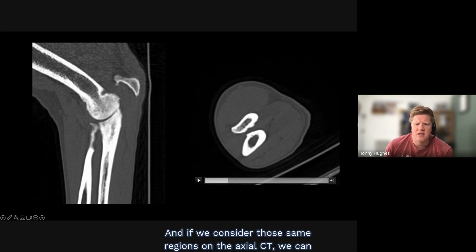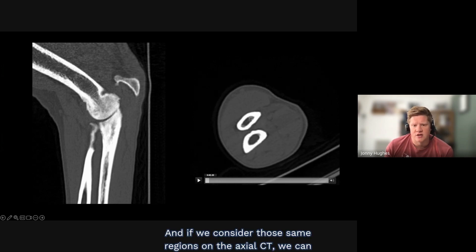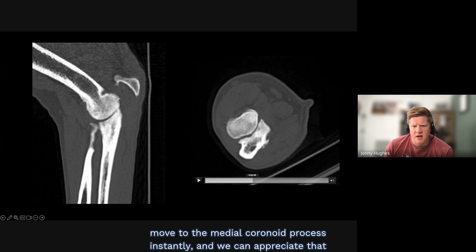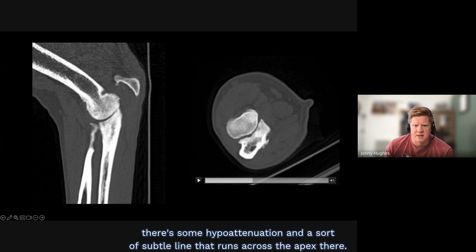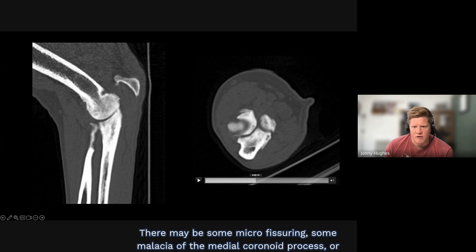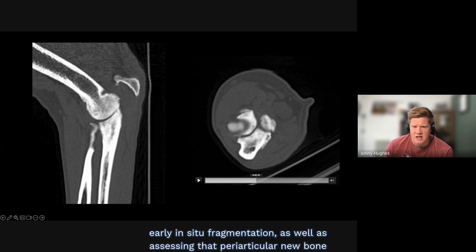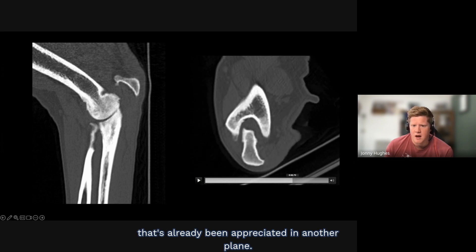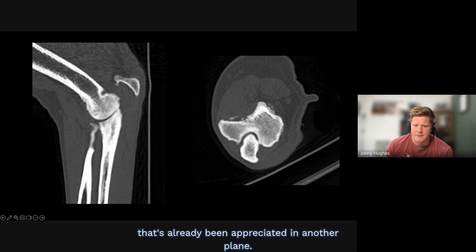Looking at the same region on axial CT, we can move directly to the medial coronoid process and appreciate hypoattenuation and a subtle line running across the apex. There may be microfissuring, malacia of the medial coronoid process, or early in-situ fragmentation. We can also assess the periarticular new bone that was already appreciated in another plane.